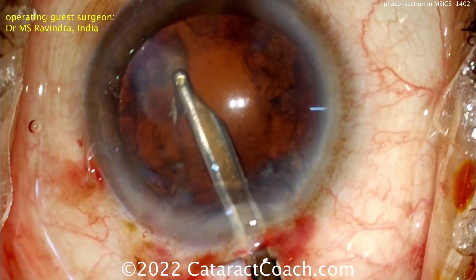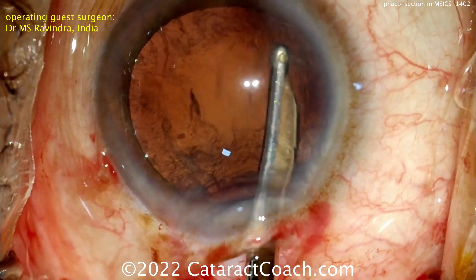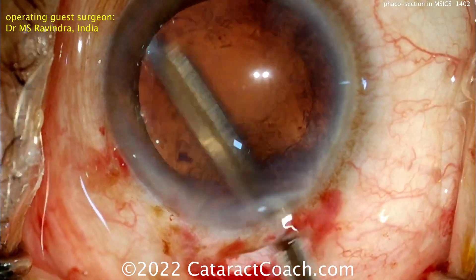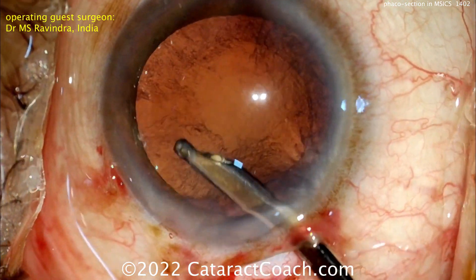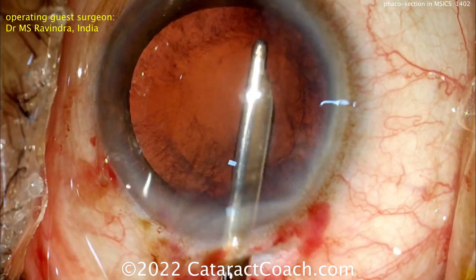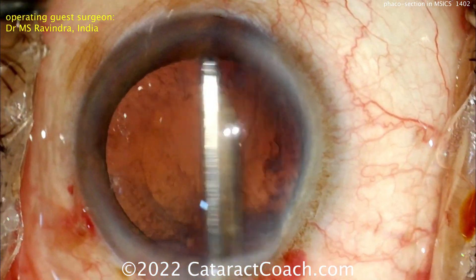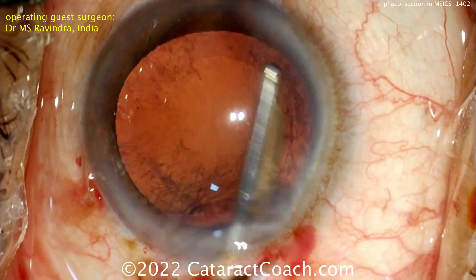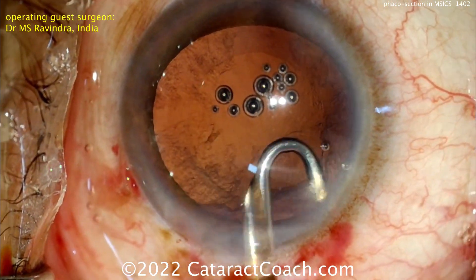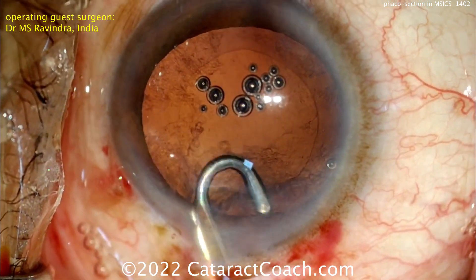Now cortex is going to be removed using that Simcoe cannula — nicely cleaning up all this lens material. This is all being done without a FACO machine, so there's no IA probe; you're using a Simcoe cannula, which is a manual approach. Just taking your time, you can really clean up all that material from the capsular bag. The J-shaped Simcoe is very interesting — you can get that sub-incisional area very nicely.